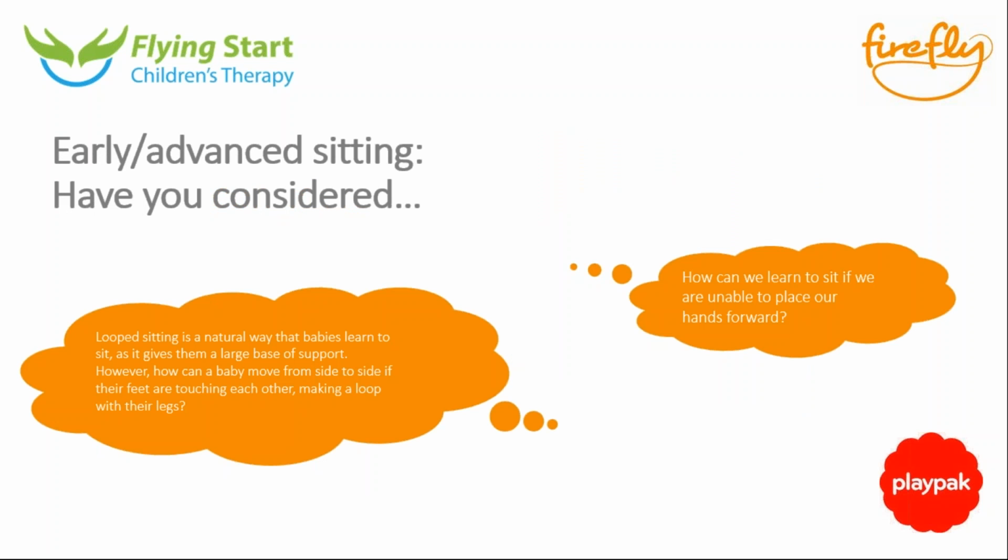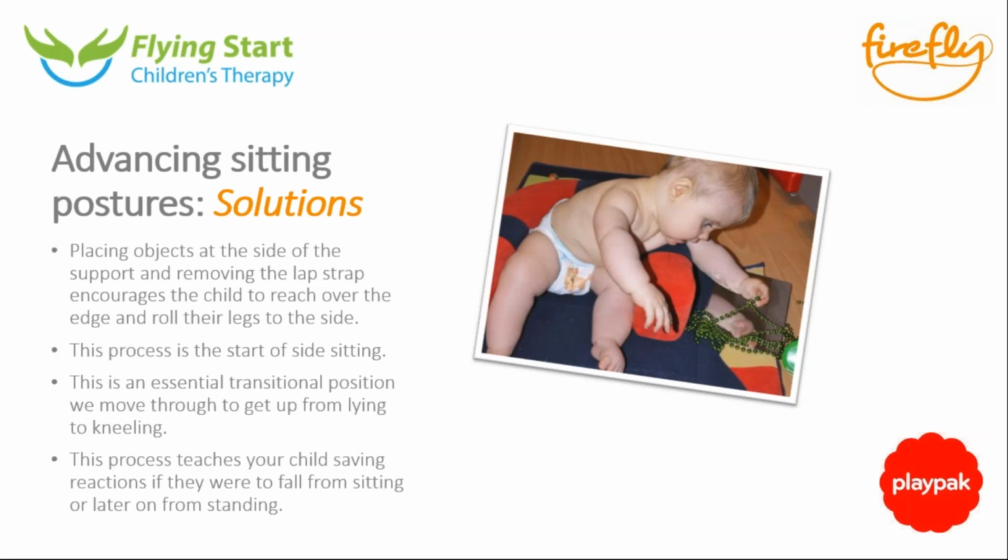The thing about this position as well is that as we're learning to put our hands to the side, even though he's not going to fall there because the horseshoe is giving a really lovely support, he's learning that he can put his hands to the side. So if he were then to progress to more independent sitting, if he was to start to fall to the side, he would know to put his hands there. And that's a really hard skill to learn.